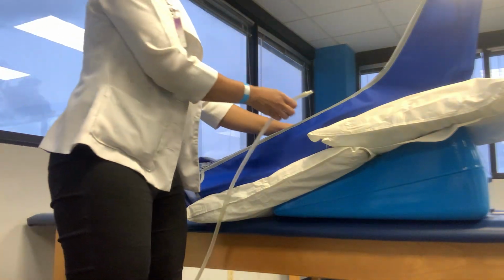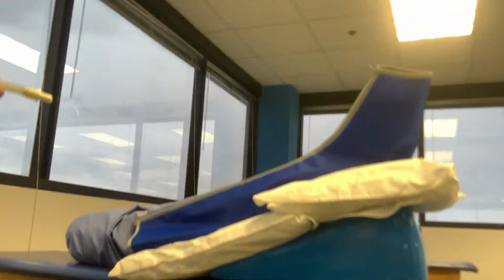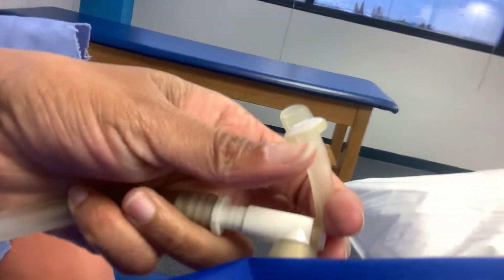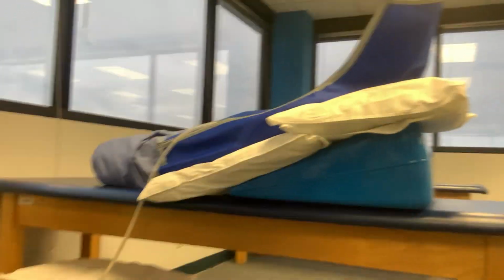So I'm going to attach the sleeve, and I will show you here that this is where the port is. And so you would open the port, the sleeve is falling over it, and then you would insert. So that's how you would attach your sleeve.